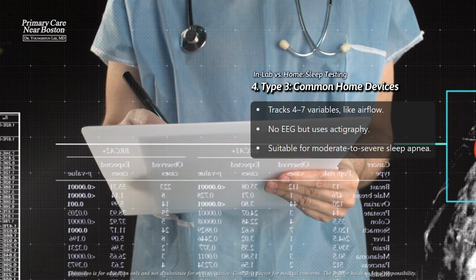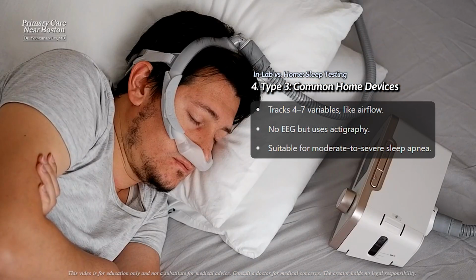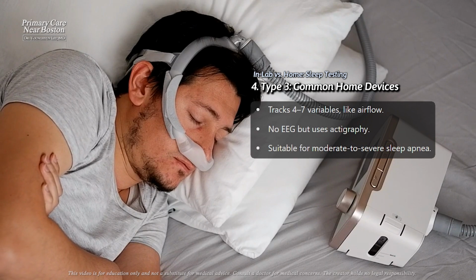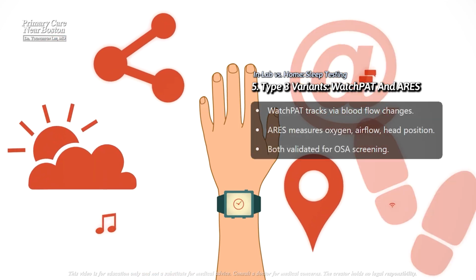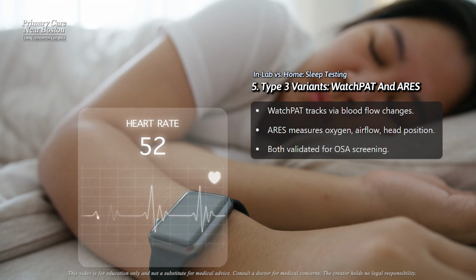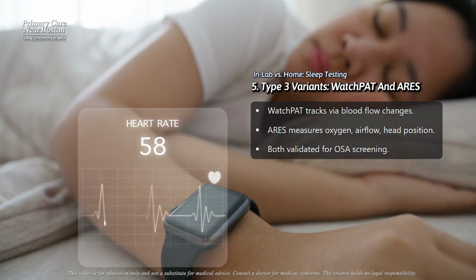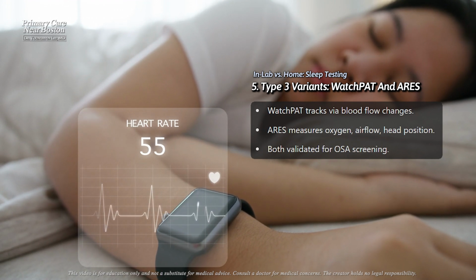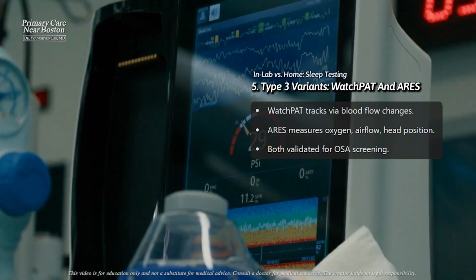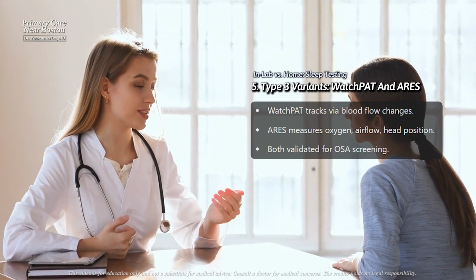These devices are generally adequate for detecting moderate to severe sleep apnea and offer the advantage of home comfort, where people may sleep more naturally than in a lab. Among Type 3 common home devices, a unique option is the WatchPAT. This wrist-worn device estimates respiratory events indirectly by measuring changes in blood flow, peripheral arterial tonometry, or PAT, along with oxygen levels, heart rate, and snoring. Although not as precise as a full PSG, it's validated for OSA screening.